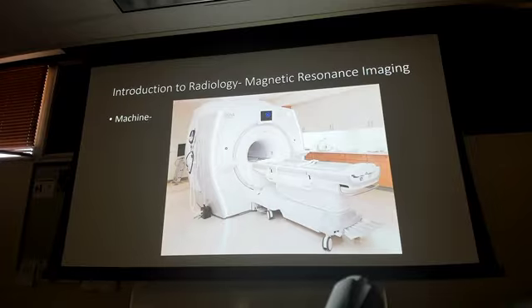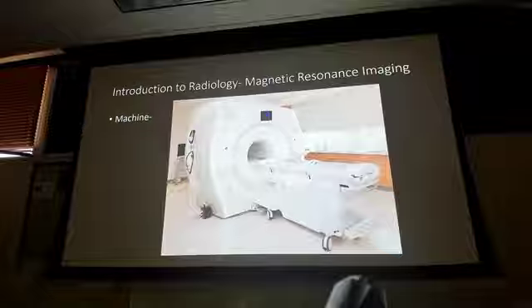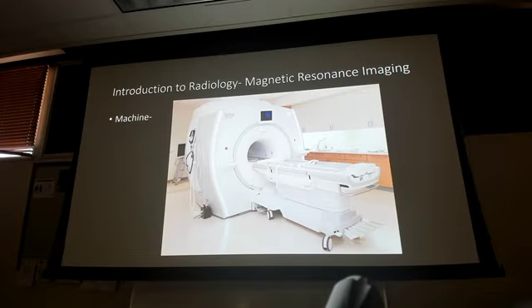Notice it's more closed off, right? Notice it's more closed off. These are patients that if they do have an issue with claustrophobia and it's been documented, you might need to give them a little something to calm them down. Because whereas I told you a CT takes seconds, this takes 45 minutes to 2 hours, depending on the scan they're doing. This is not a quick scan. So if they have issues with claustrophobia, this is the time they may need a little additional medication. You'll hear that in pharm.